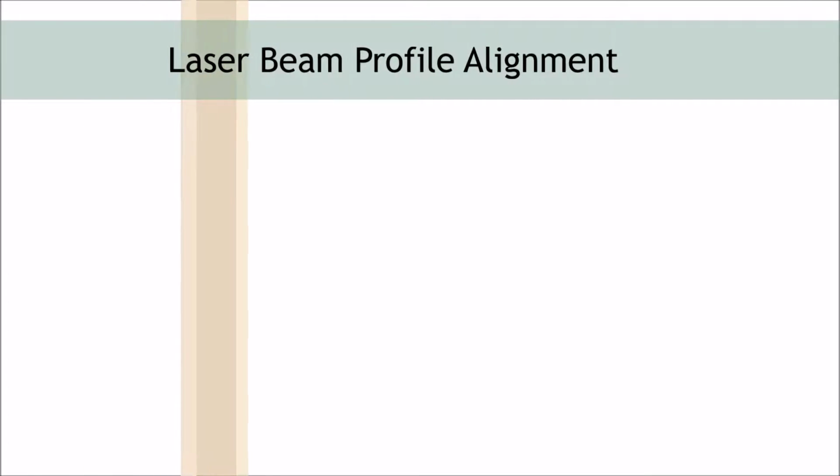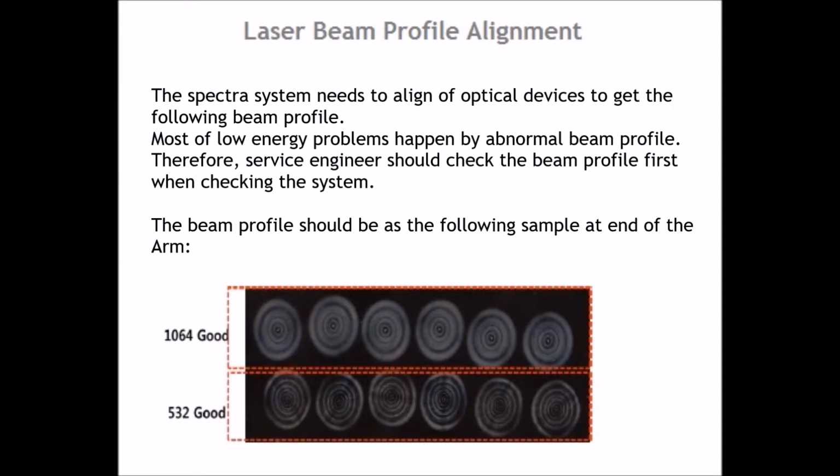Laser beam profile alignment. The Spectra system needs to align optical devices to get the following beam profile. Most of low energy problems happen by abnormal beam profile. Therefore, service engineers should check the beam profile first when checking the system. The beam profile should be as the following sample at the end of the arm.